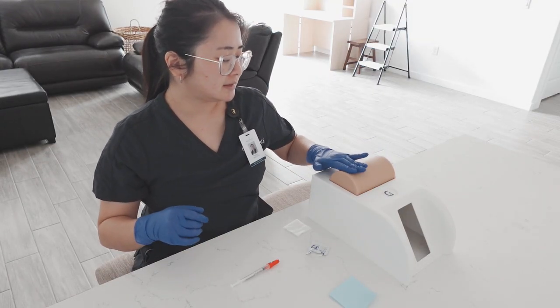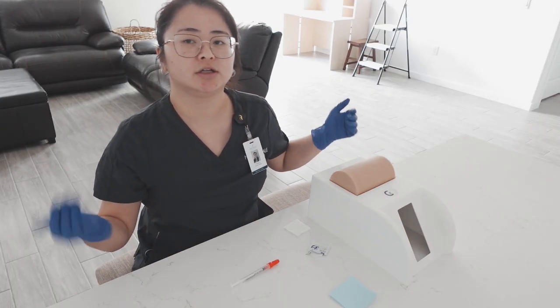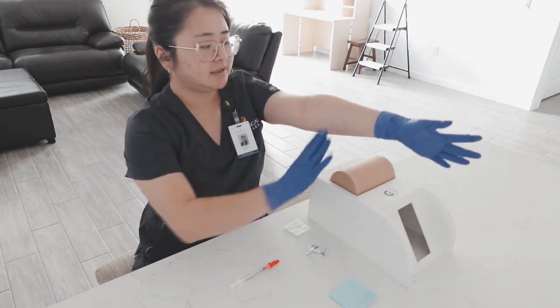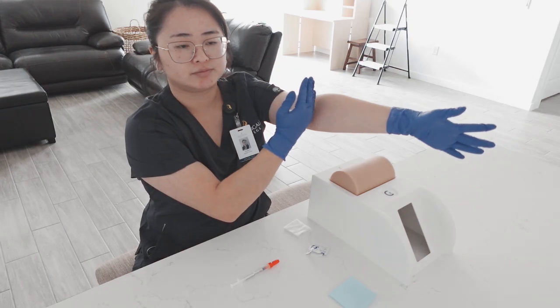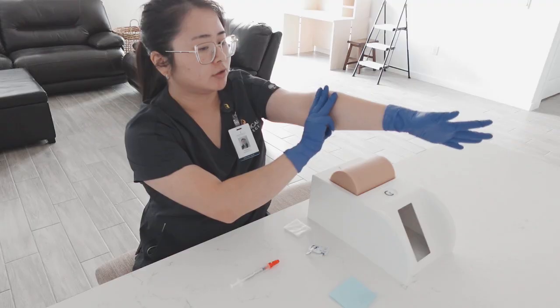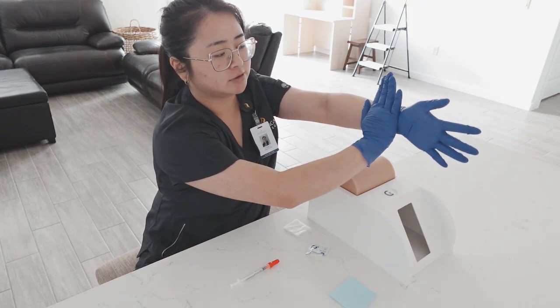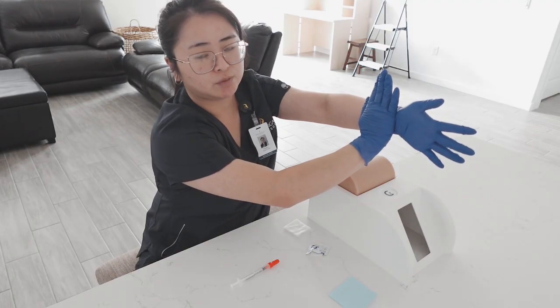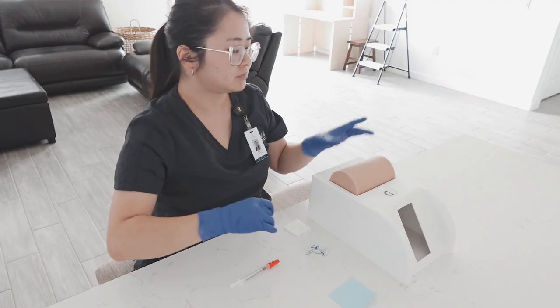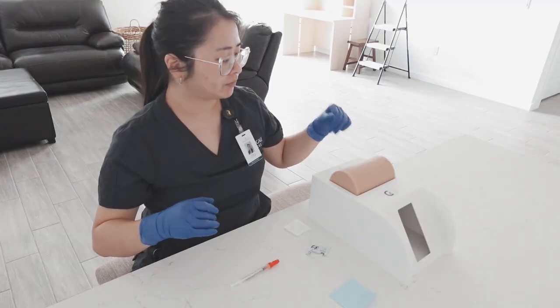Now, for this patient, we are doing his forearm, but if the forearm is not available, you can use the upper back. On the forearm, it needs to be below the antecubital. It has to be 4 fingers or 3 fingers. And then above the wrist is supposed to be a whole hand width. So right here in the middle is where we would do the injection site. That is where this is. So this is where we would have it.